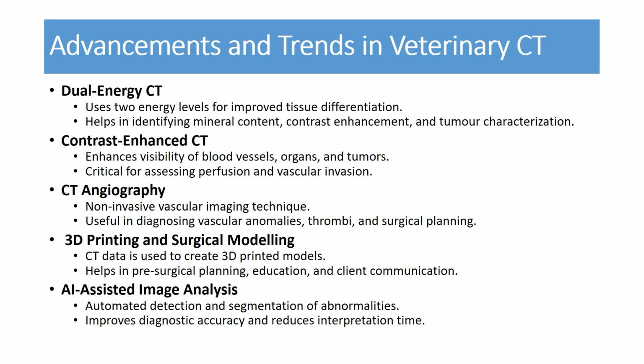So let's discuss the advancements and trends in veterinary CT. Dual energy CT is being used nowadays. It uses two energy levels to improve tissue differentiation. It helps in identifying mineral contents, contrast enhancement, and tumor characterization.